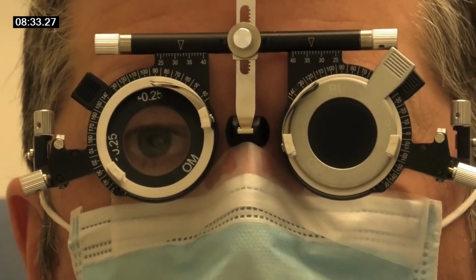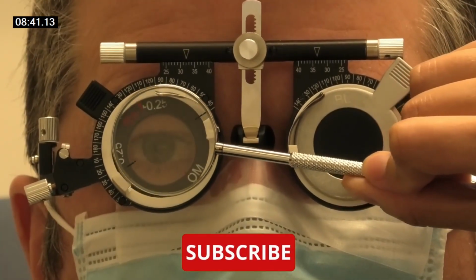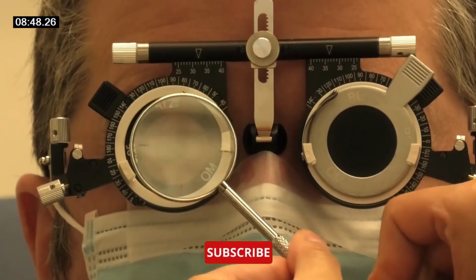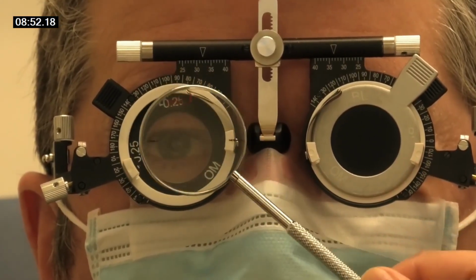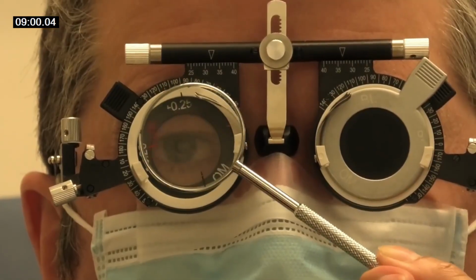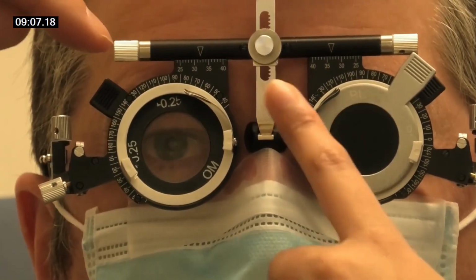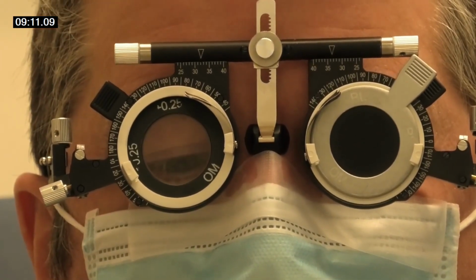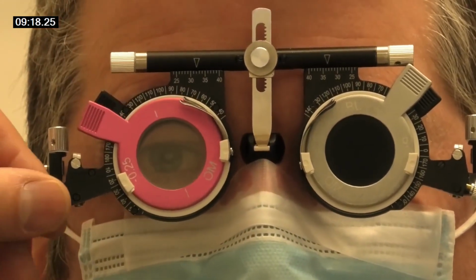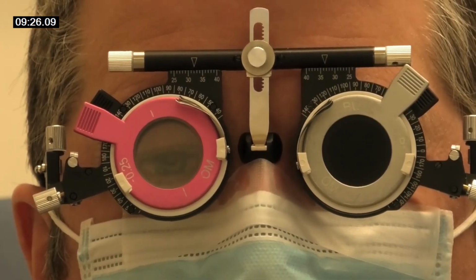Okay. So just looking at that circle, is it clearer with lens 1 or lens 2? 2 slightly. 2 slightly, so he likes that one. So what we've got to do is, that's it, that's that one. And again, is it clearer with lens 1 or lens 2? I think 1. But it's not as clear as without, is that right? Yeah, that's right. So he likes that one, and he likes this one. So we've got to put a tentative lens in about here, isn't it? That's it. So let's put it in at 110. And so he's got very good vision.